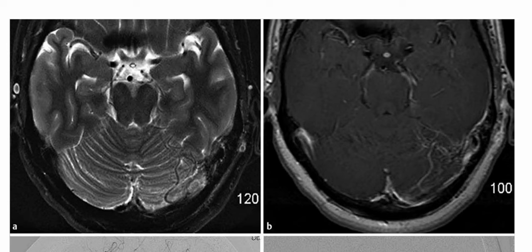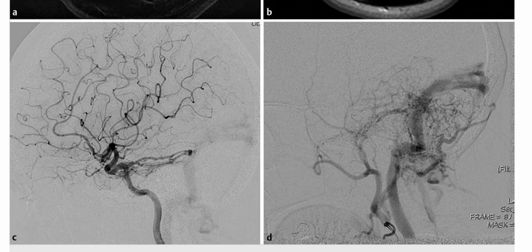And these are the lateral images from the digital subtraction angiogram, with selective injection of the left internal and external carotid arteries, which are showing the early filling of the transverse and sigmoid sinuses during the arterial phase imaging.